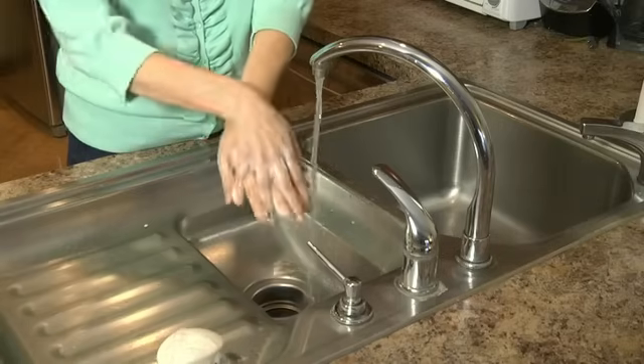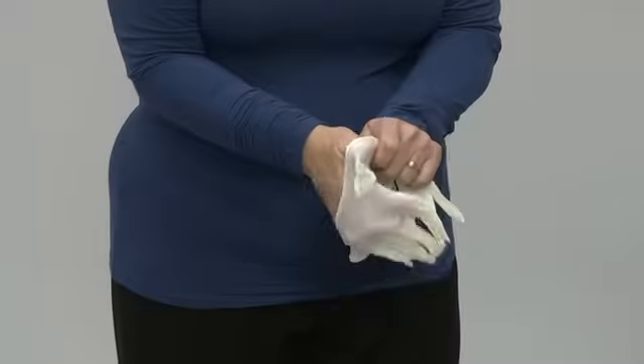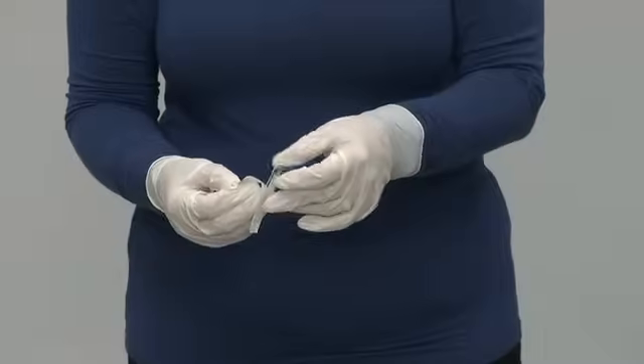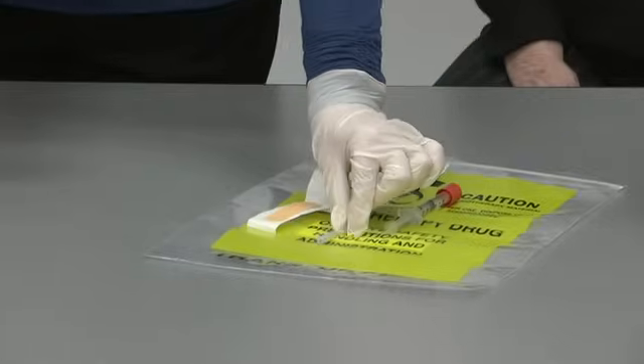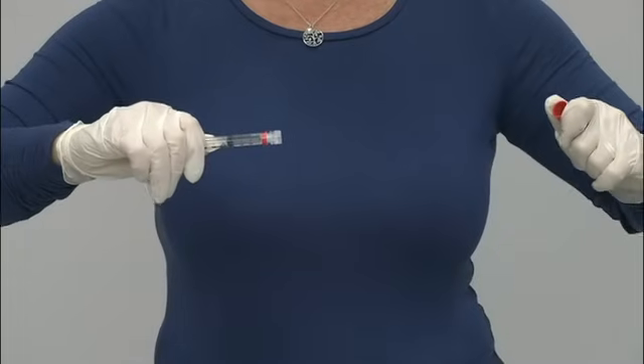Wash your hands with soap and warm water and dry them with a clean towel. Put on gloves if you're giving the injection to someone else. Open the wrapper of the needle, leaving the needle cap on, and set it near you.